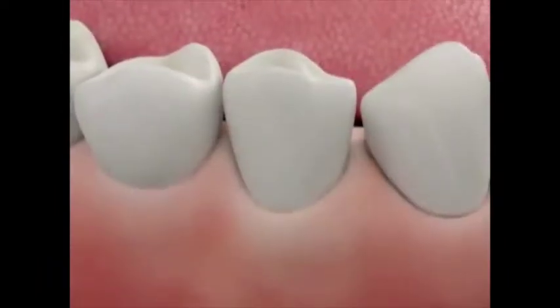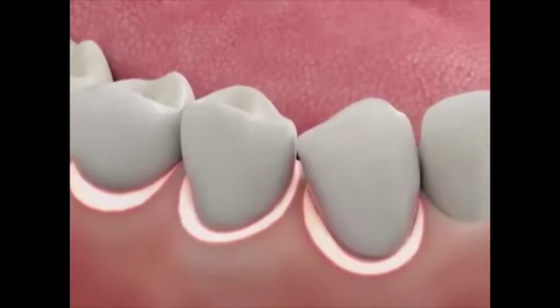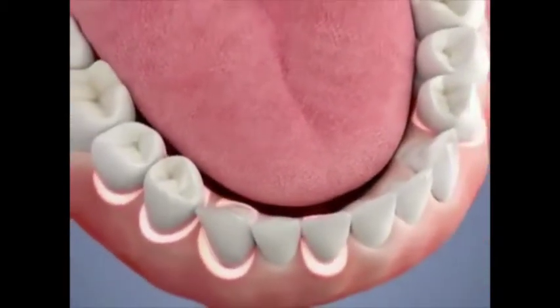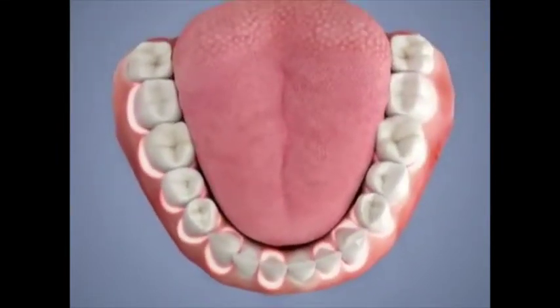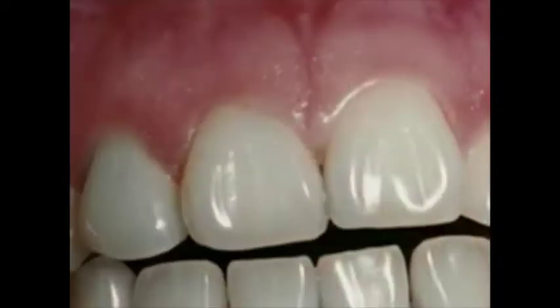If you have just a few pockets of infection, we may treat just those teeth. But if the infection is more widespread, we may treat 1 or 2 quadrants of your mouth at a time, spacing the treatment over several appointments. Scaling and root planing removes the source of infection, helps your gums heal and tighten around the teeth, and gives you back your healthy smile.